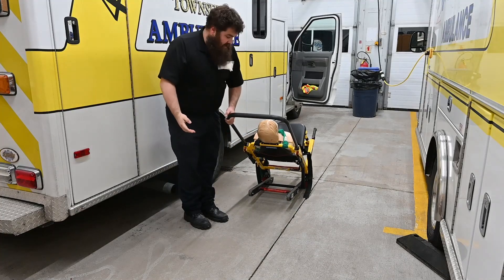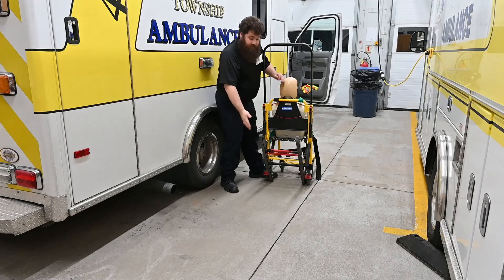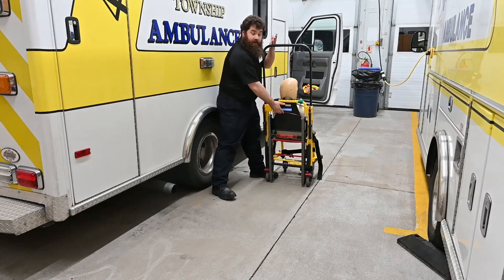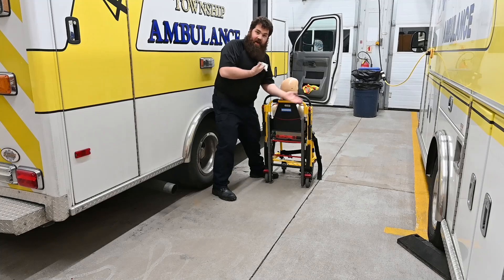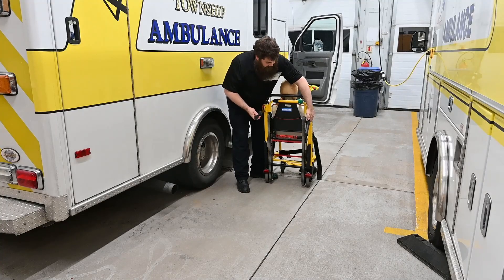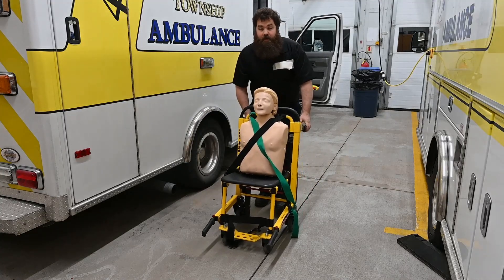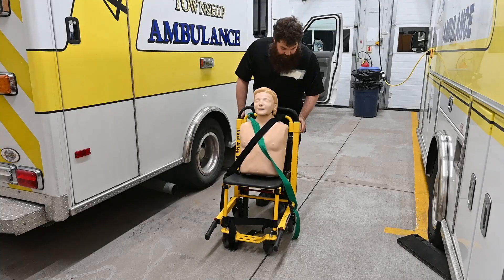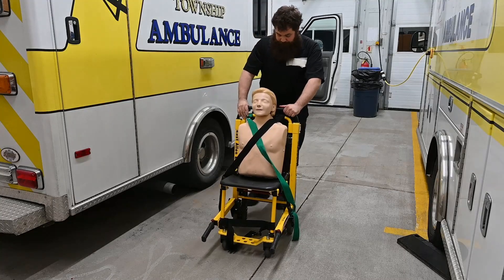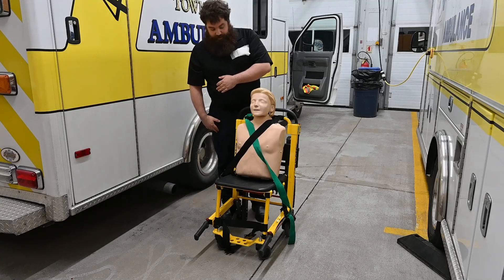We'll slide them on the tracks down the staircase and then bring them back up. Once we're down on a flat solid surface, we close up the tracks, lower the handle, re-engage the wheelchair handles, and continue to wheel the patient to wherever our stretcher may be. At that point we lock the wheels and assist them from the stair chair to the stretcher.